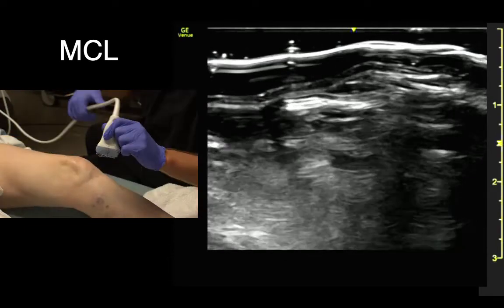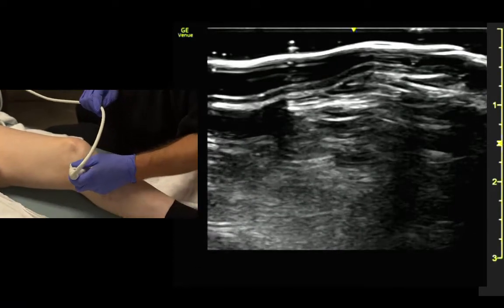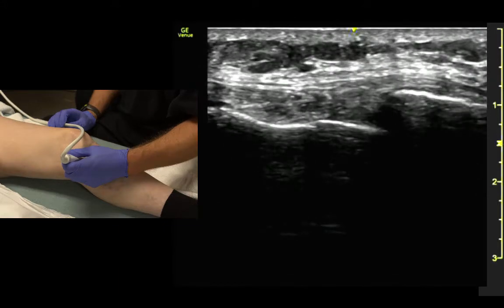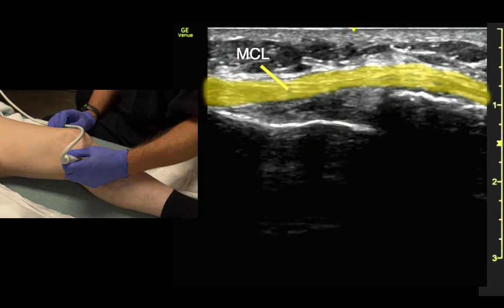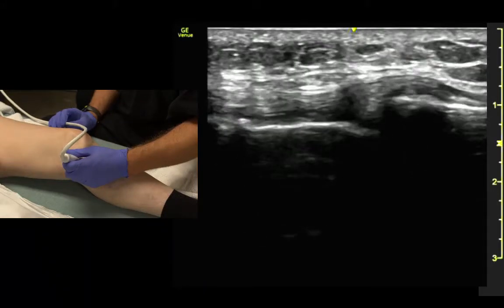Next up is the MCL. To find it, we come right around the joint space indicator, towards the patient's head. We find the joint first, and once we see the joint space, we see the ligament lining up on top. You can see the ligament in there.